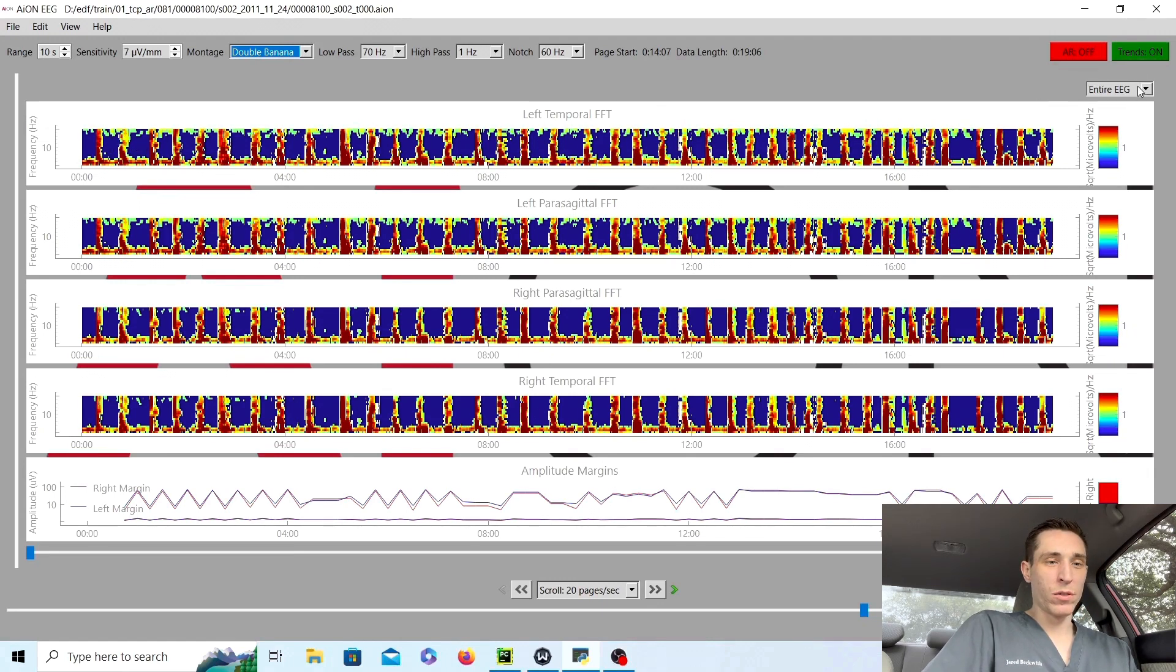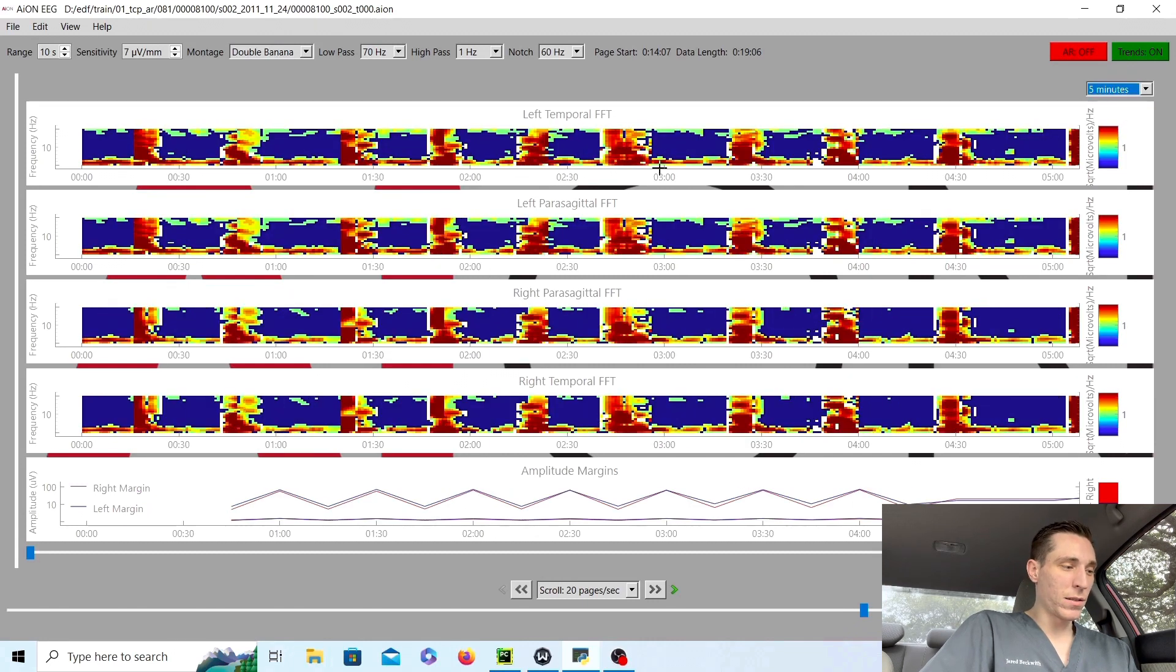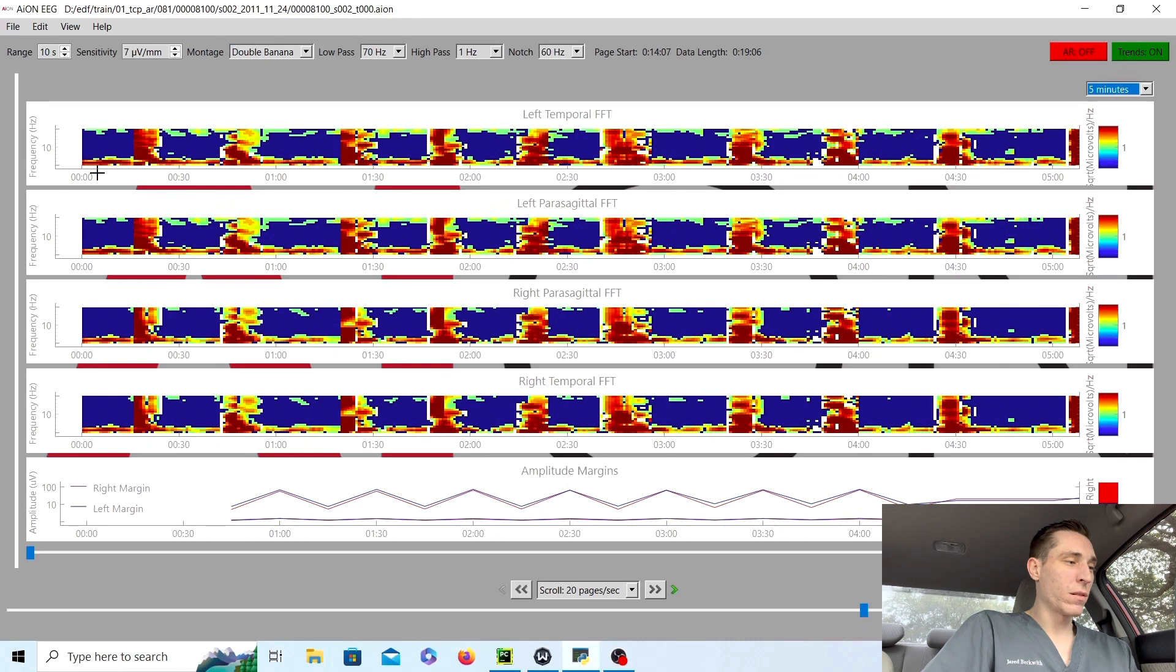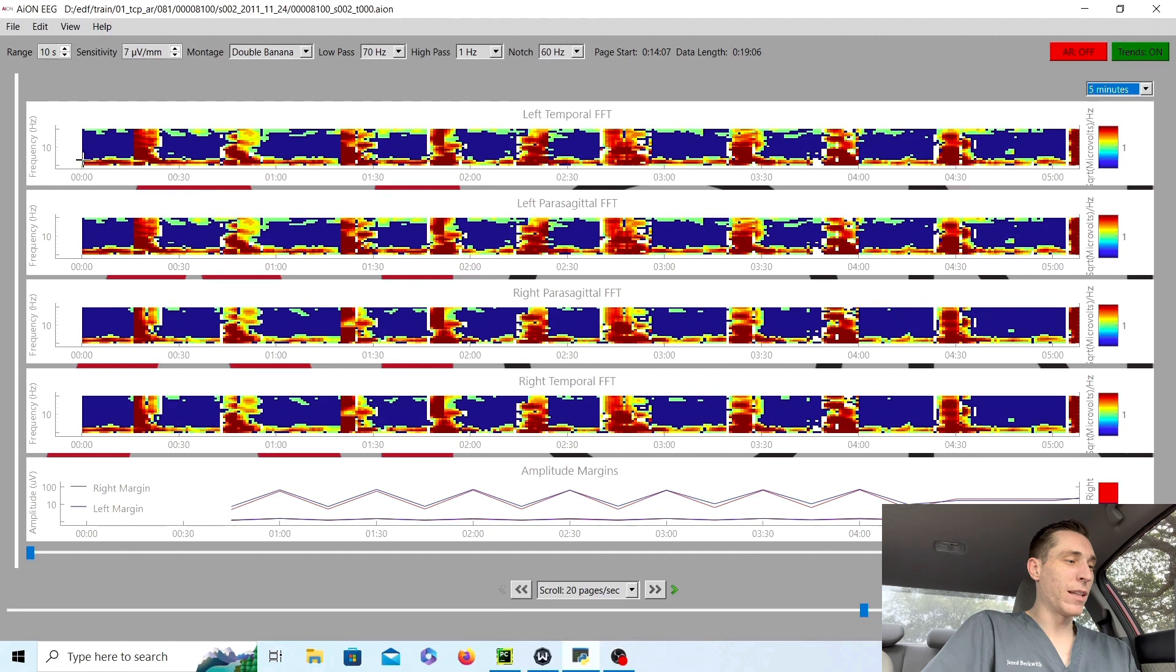And if we zoom in just a little bit so we can see five minutes, here is the frequency. It is essentially all blue, dark, nothing happening except at the bottom, which is like one or two hertz, one or two waves per second. Flatline, flatline, flatline, burst.